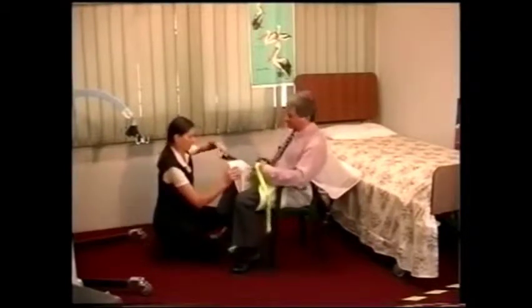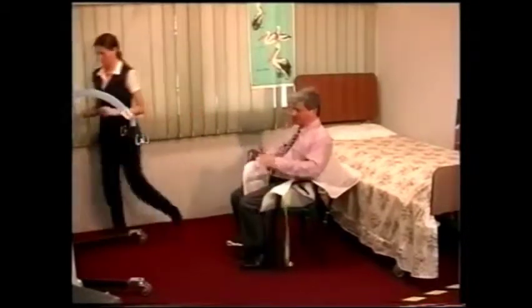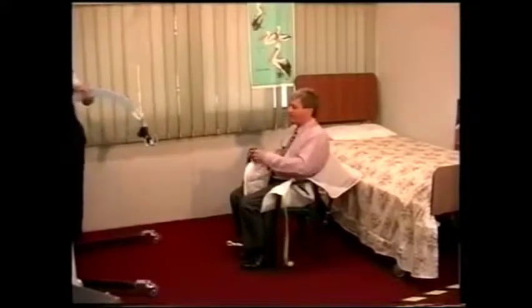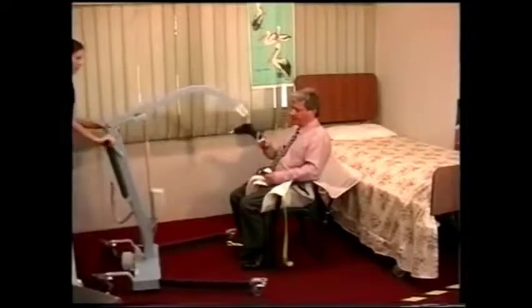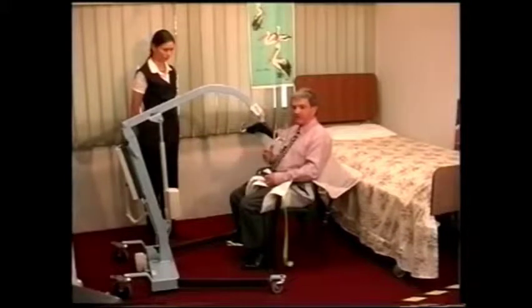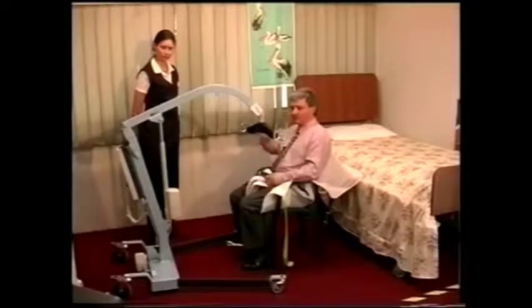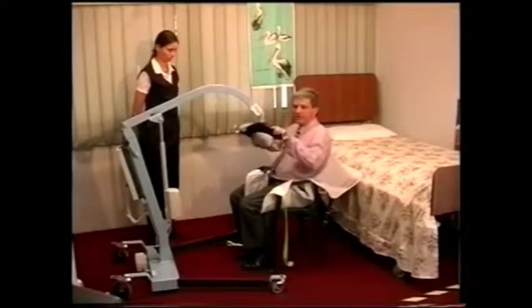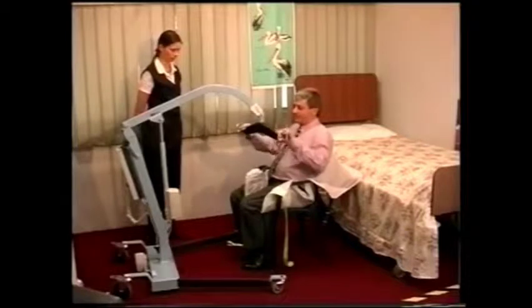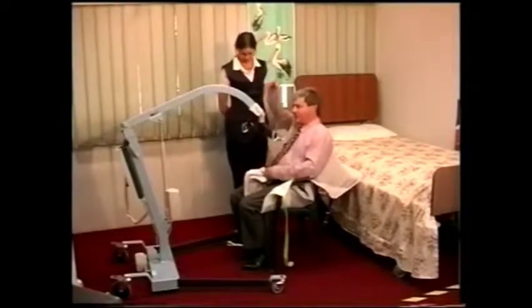Some people like to have the brakes on, and some like to have the brakes off. But I'm of the opinion it's better to leave the brakes off, because when the hoist is on level ground, it's not going to run away anyway. It's just going to stand there until you're ready for it. When you're picking up, if you have the brakes on, the person is lifted out of the chair if the hoist isn't forward enough. Whereas if the brakes are off, the hoist will just creep in towards them until their center of gravity is directly below the spreader bar here, and that will take them up in a nice even pull.